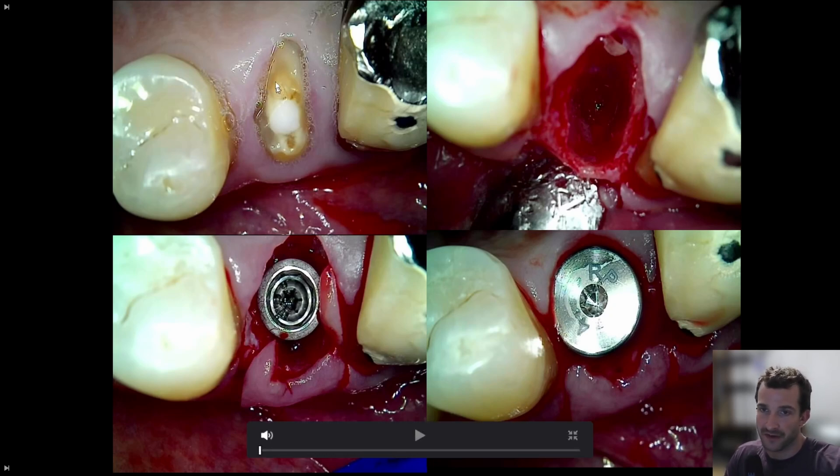Here's the initial situation: tooth #15 fractured off at the gum line. We planned to do an implant, so we did an immediate approach — extracted the premolar, placed the implant, put the healing cap, and then three months later we'll restore the implant.